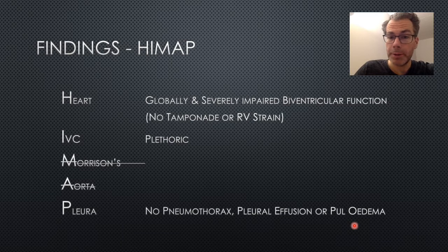So when I went in to see this case, the team had quite a broad differential. They were drawing up IV antibiotics to cover for sepsis. There was really no particular suggestion of any specific condition. But within a couple of minutes, we had a clear diagnosis. I could tell them, this young man has clear signs of cardiogenic shock. There's no other signs of any obstructive shock or anything else going on. I'd recommend hold off the fluids, start him on some inotropes.